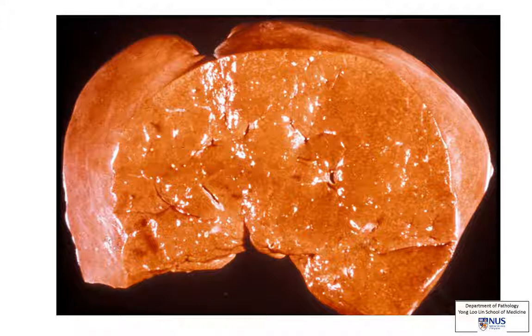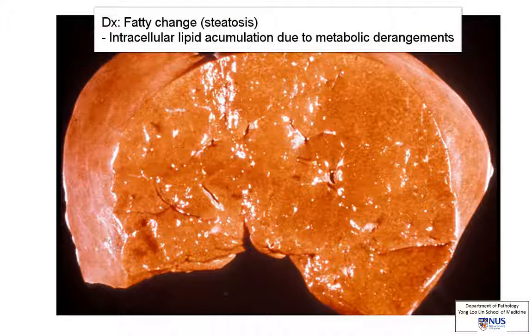So this is fatty change in the liver. It is lipid accumulation within the hepatocytes due to some sorts of stresses or metabolic derangements.